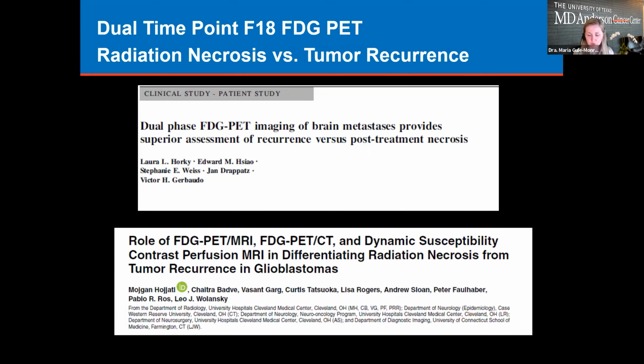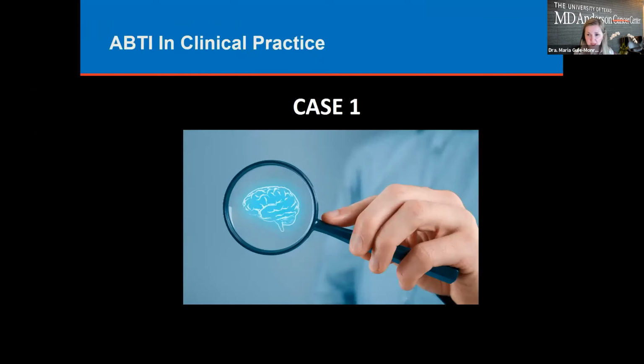At MD Anderson, we have operationalized this model and incorporated it into our ABTI, or Advanced Brain Tumor Imaging Program, and have done more than 200 cases of delayed PET with great results. Now let's turn to a few cases. I hope nobody has fallen asleep yet.